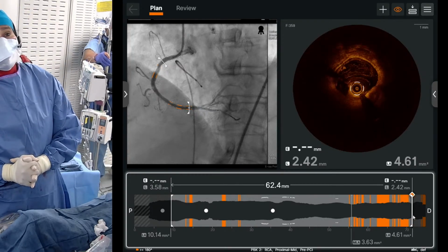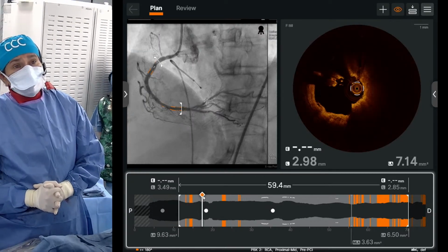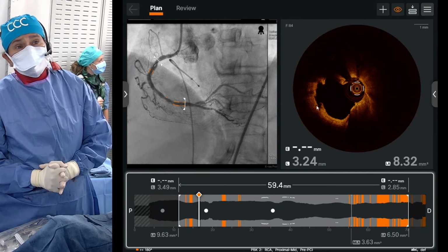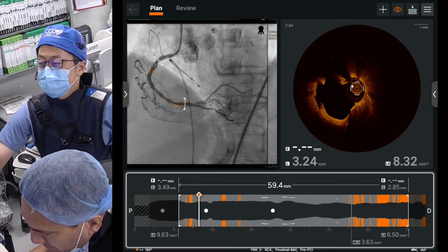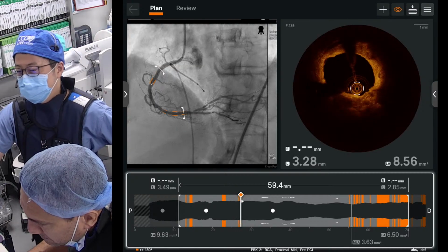Okay, then exactly, let us go where the nodule is, the proximal, where the rotor took us a long time. Yeah, right there. Shaved calcium and some dissection. And where's that nodule? Nodule is already shaved. Shaved. Shaken and shaved, both. You got that? So now we are ready to stent.